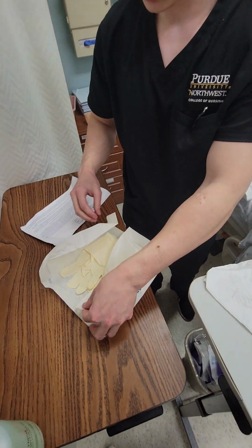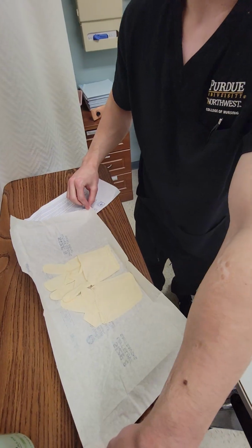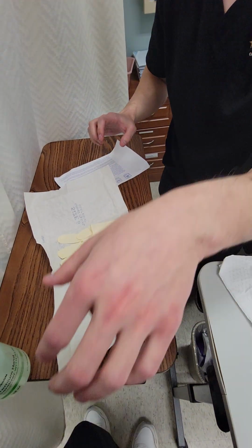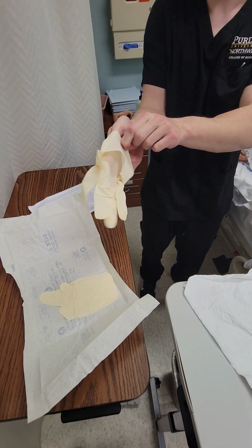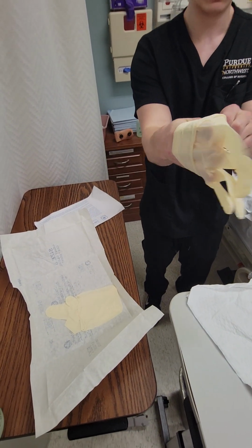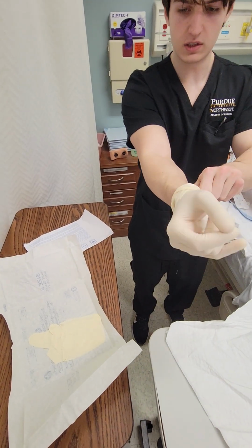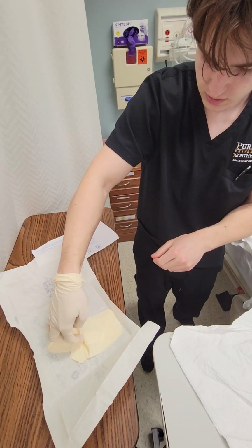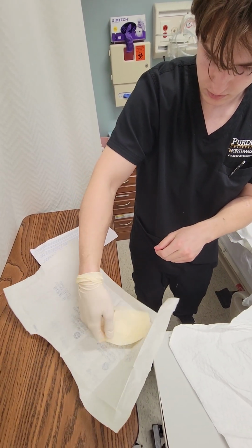Come up for this side, drag these. Alright, stay down. Turn away from the curtain to avoid accidental contamination. We'll be using the scoop technique for the second glove.